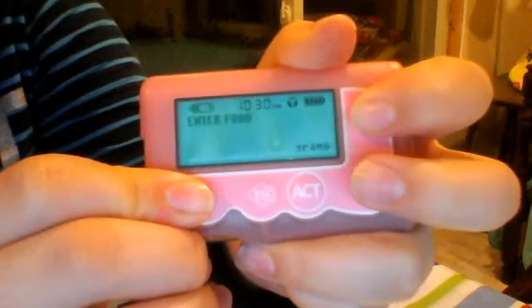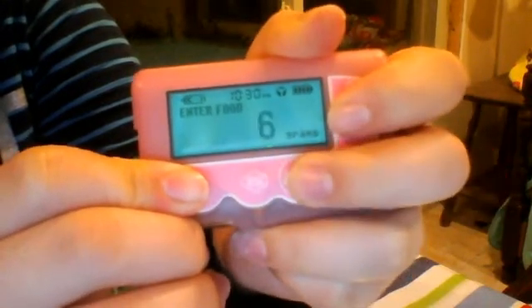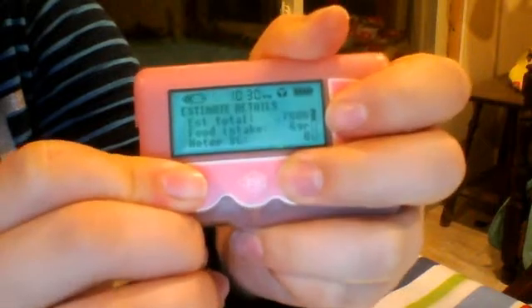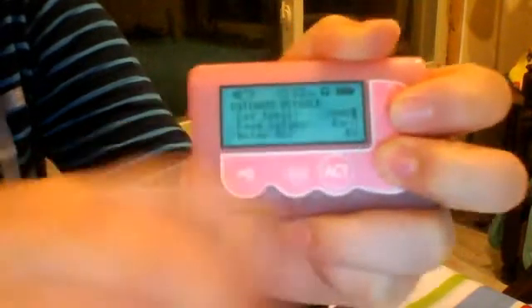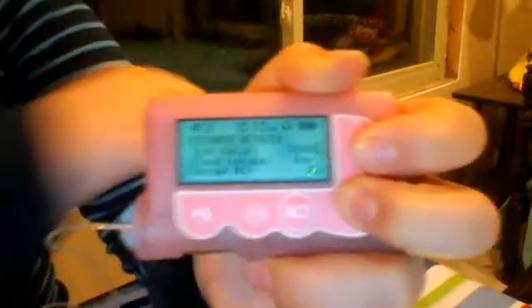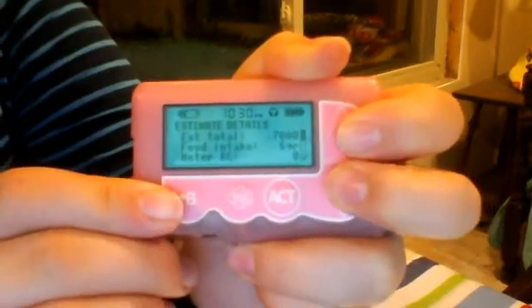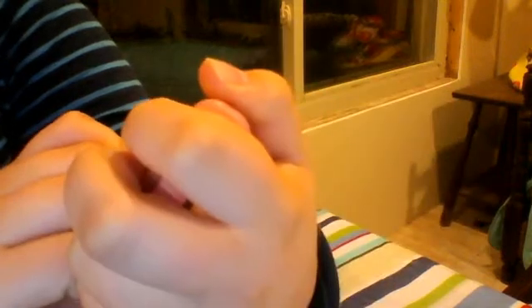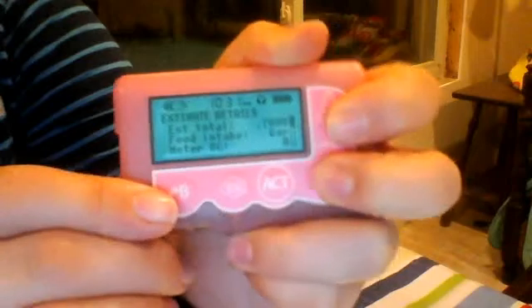I just actually had six carbs. So you put in your carbs, you press ACT, and then it goes to estimate total — 0.7. This is different for everyone, as your carb ratio and everything is programmed to what your doctor puts it at. So for my dose, six carbs is 0.7 units.